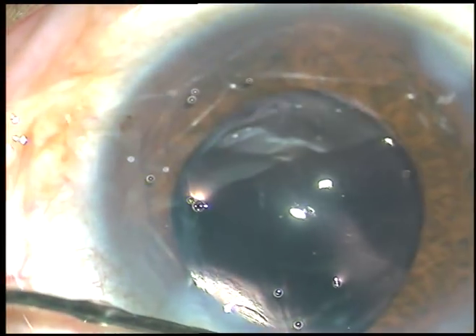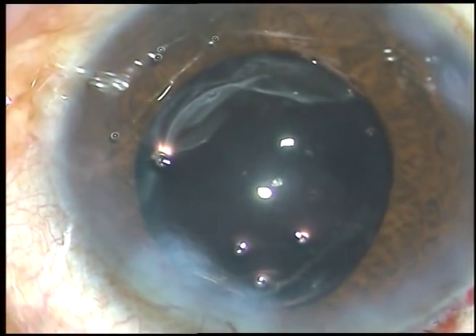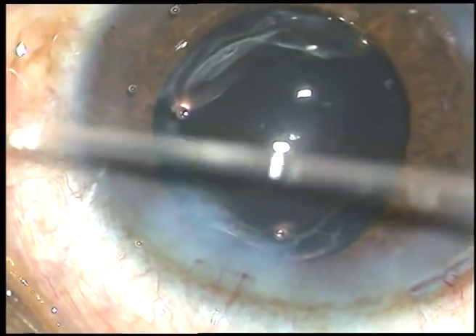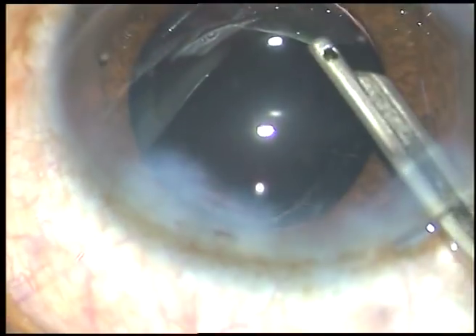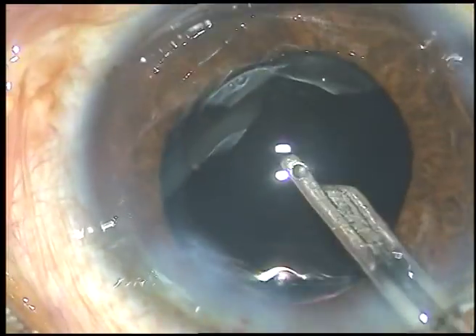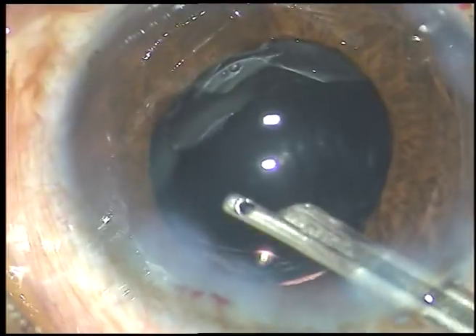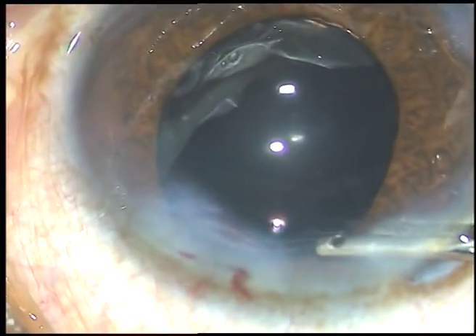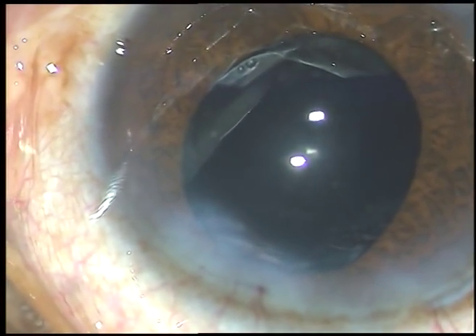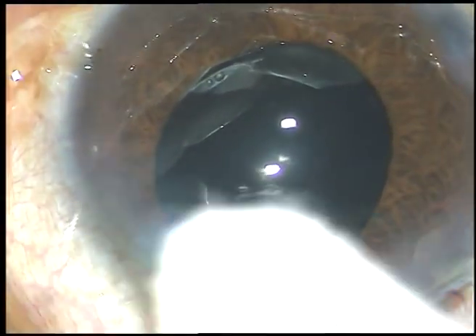This is hydration of the stroma on either side of the intraocular lens to make these wounds watertight. Now this is the final lavage of the anterior chamber — remove whatever material is there, like viscoelastic sticking to the corneal endothelium. That's it. Thank you very much for watching. Hope this video will help you in developing your surgical skills.